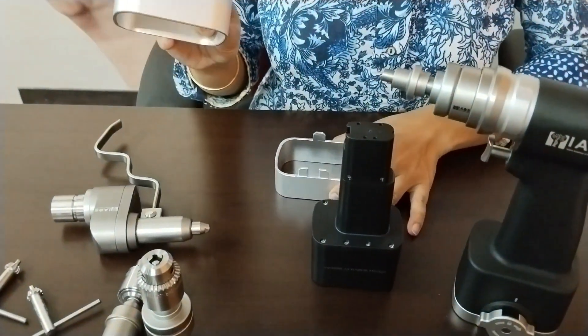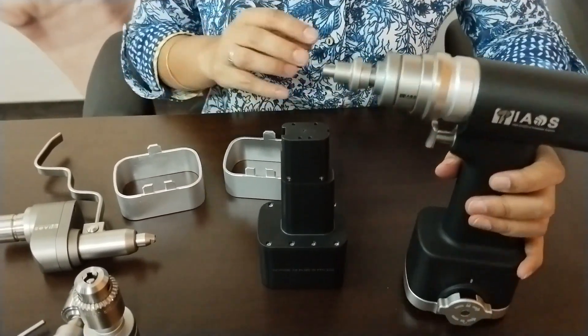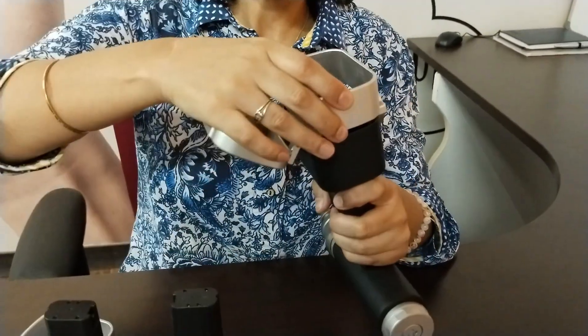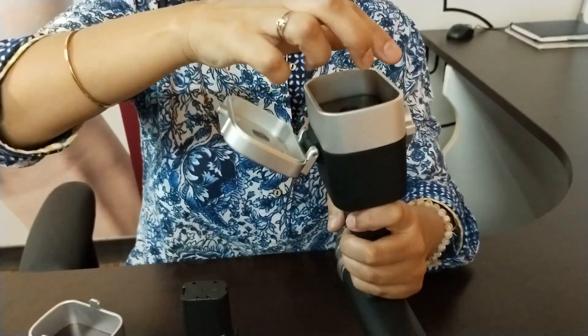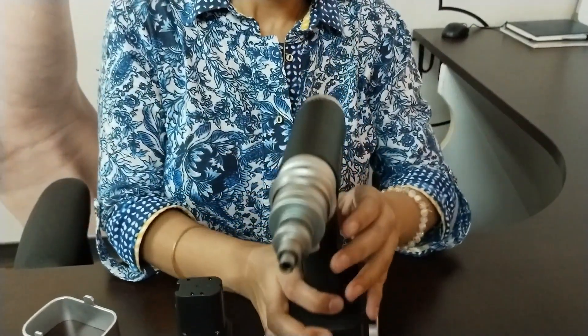We have battery transfer rings. These are a simple profiled design provided for the transfer of the non-sterile battery. You first place the battery transfer ring, then insert your battery, remove the ring, cover the lid, and close it to ensure it is sealed.